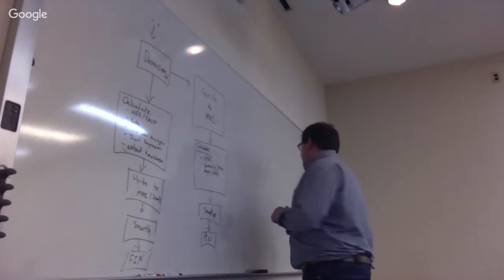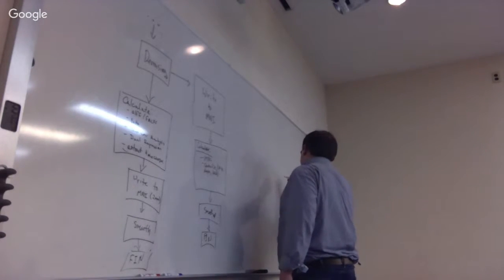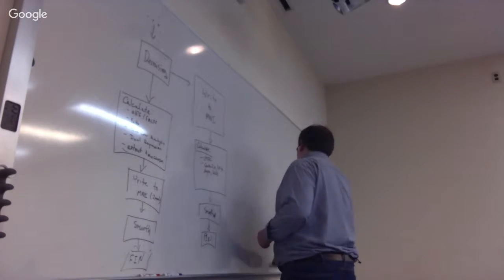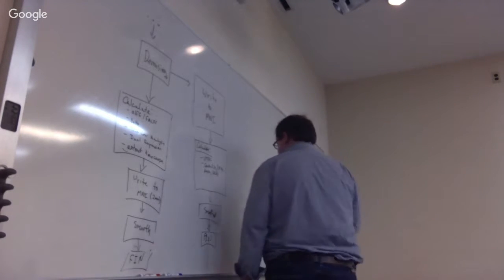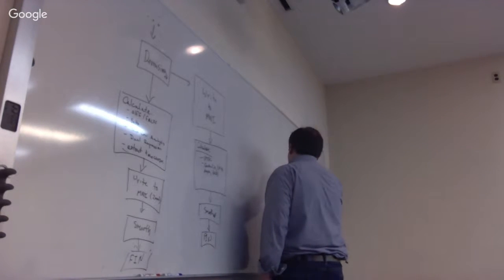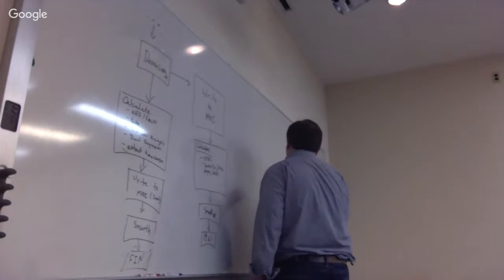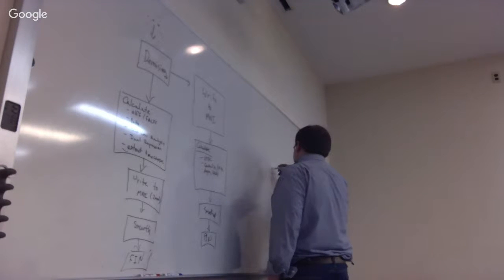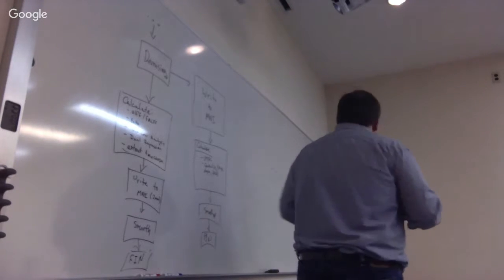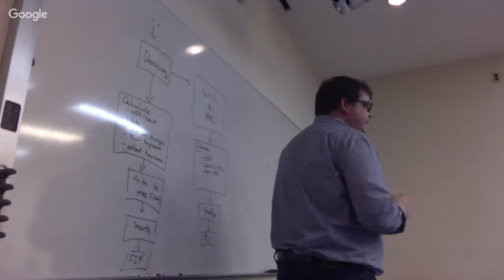So think about it. Say we call, whatever, H, J, omega. What's the best way to call this? But say we have a capital S that's the smoothing that we actually do ourselves, right? So we'll call that S. But then there's some smoothing that's due to interpolation for copying it in space, right? There's some smoothing in here that is due to motion correction. But do we have a way to estimate the smoothing of the manipulations that you have done before, or is it almost impossible? You can. You can. And that's kind of what we're getting at.